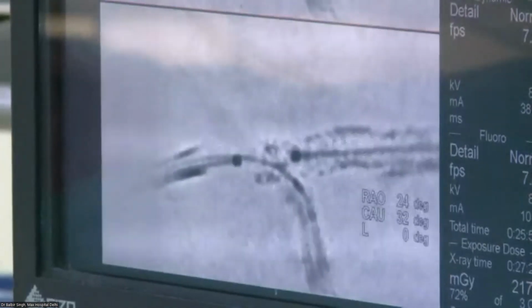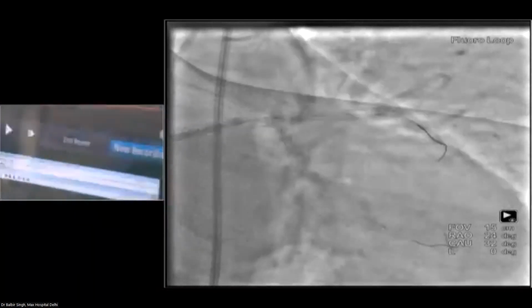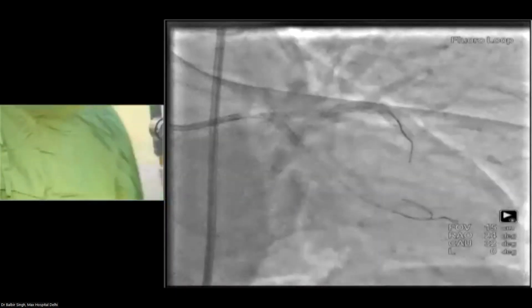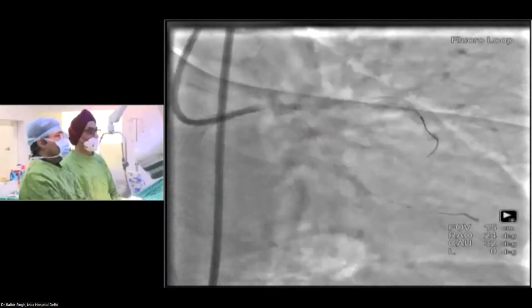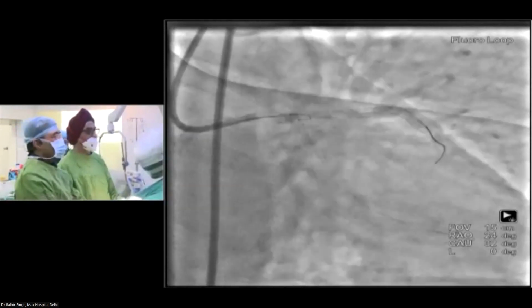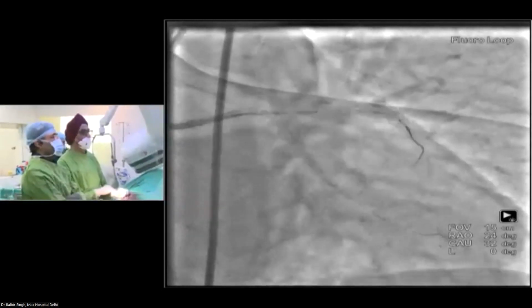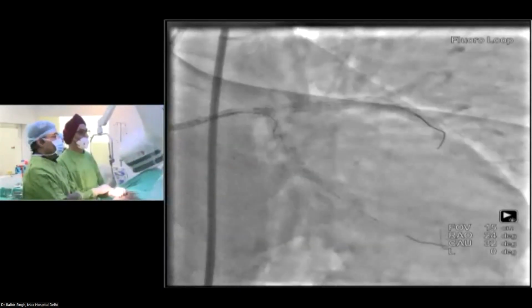We will show the angio, now we'll leave this. Okay, so we corrected this. Now you can clearly see we are much better off. Next. We got the third wire in. It was quite easy this time to get the third wire in because we had much bigger space. So this is the next trick for youngsters: try to go into the loop to the LAD, then come back. You have much lower chance of getting into problems.